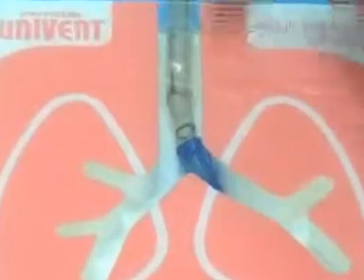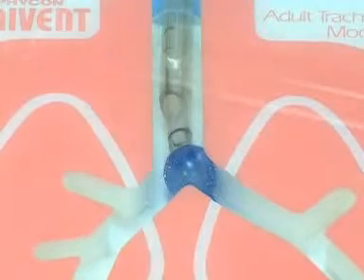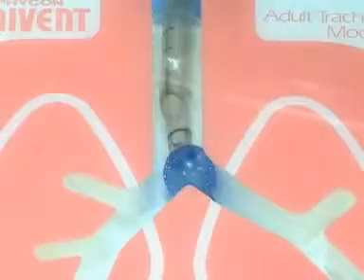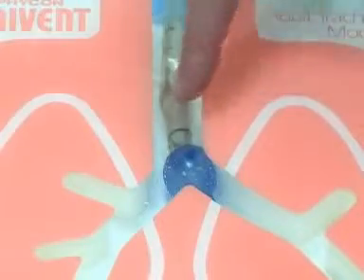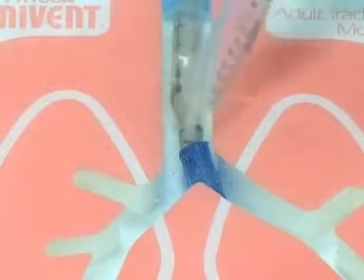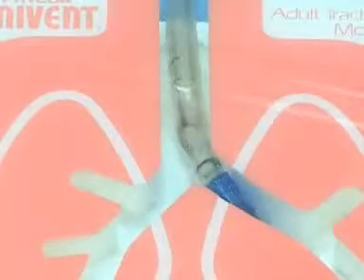So you put the tube in, inflate the tracheal cuff, inflate the bronchial cuff, and then when you look down with your fiber optic, you're wanting to see the carina but just can't — you see part of the trachea and the blue cuff obscuring everything. What do you do? Deflate the bronchial cuff. Sometimes then you'll say, 'Aha, there's the carina.' Then just advance it a little more and you're in good shape.